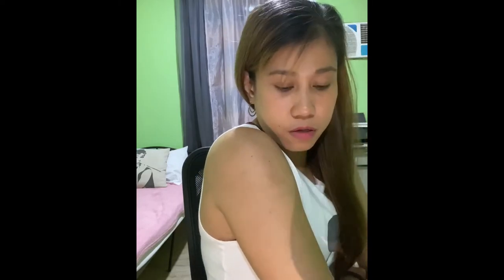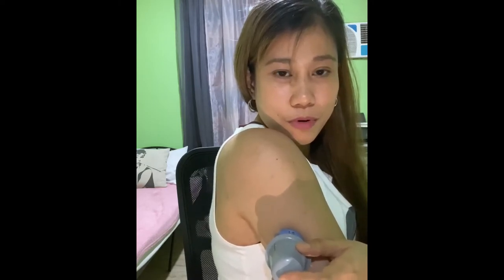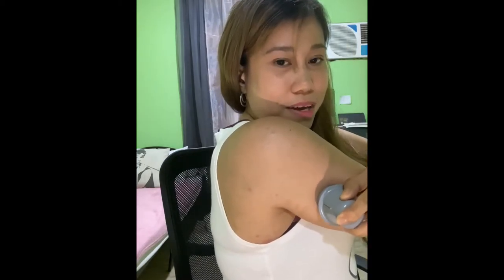Make sure the area is dry before you apply it so it really sticks. This is the scary part — when you push it in — because the needle goes in, and then it disappears. Hold it for maybe 30 seconds to 1 minute.